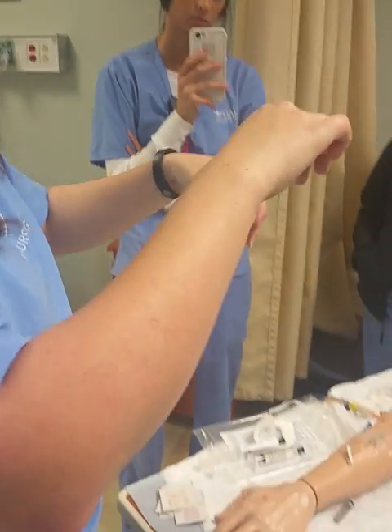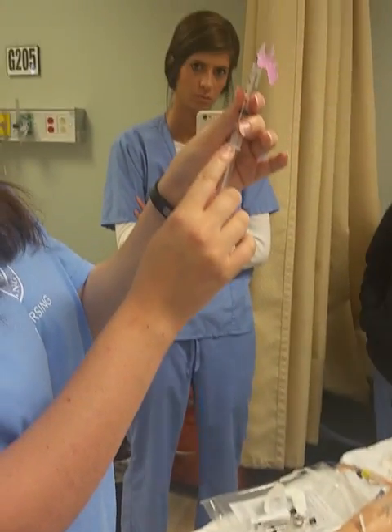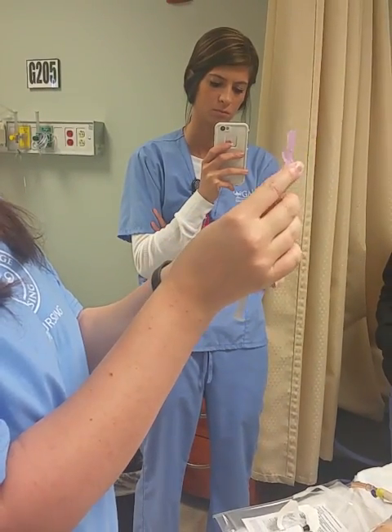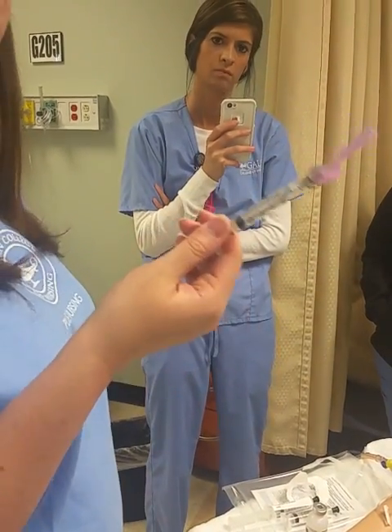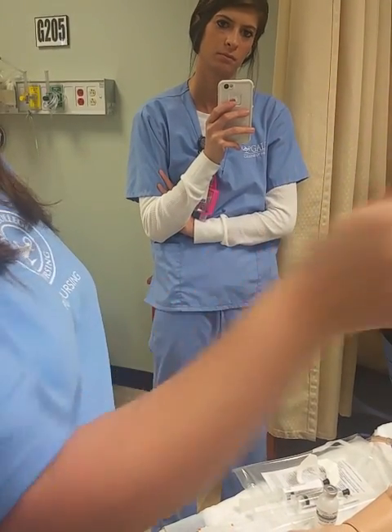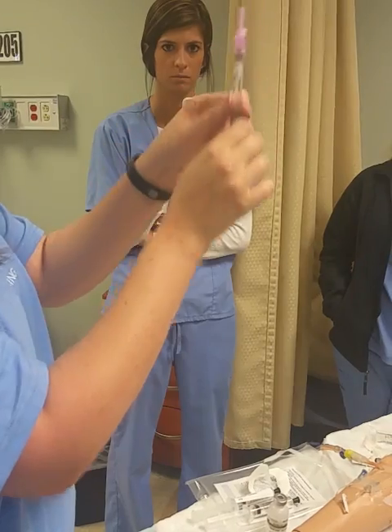Two mLs of Lasix. Now, because I'm not going to need this needle because this is needleless, I'm going to go ahead and pull my syringe back to get it out of my needle, and then I'm just going to flip the safety. That way, I don't have to worry about sticking myself, but my needle's covered. So if we were in the med room, you could take it like this. Just make sure it's labeled. Sorry, I have an air bubble in there I'm trying to get.